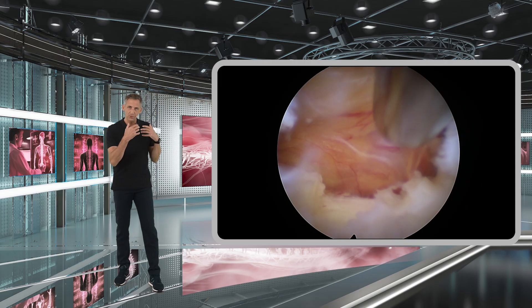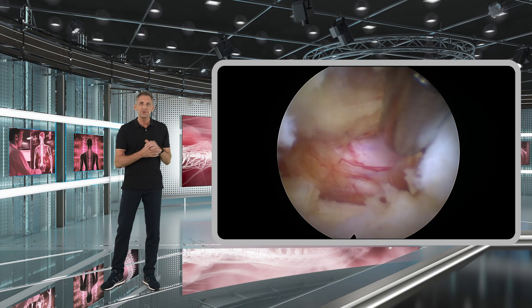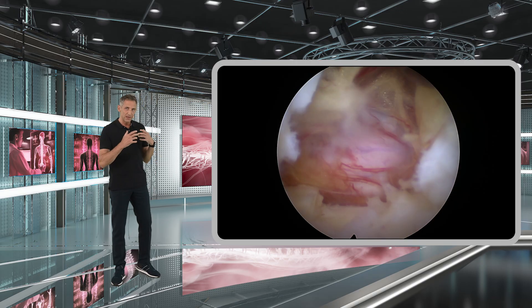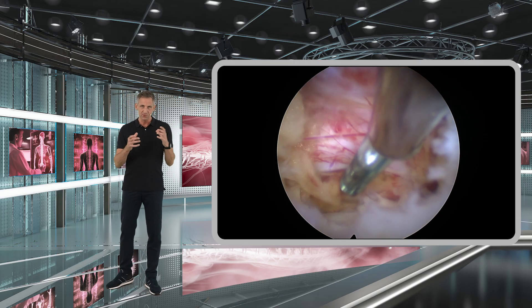You can see in this video that once you remove these spider web tissues, you get a really fantastic picture and a really clear vision of all neural structures and of the intraspinal anatomy.